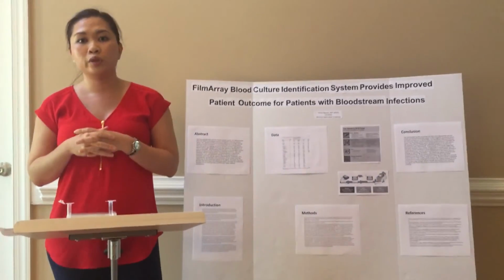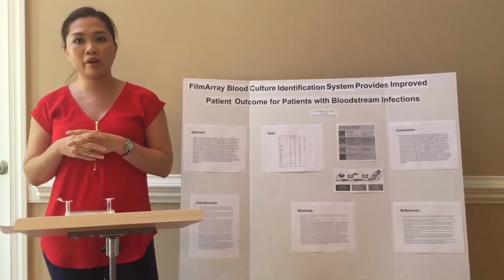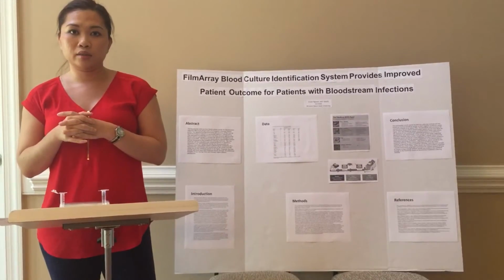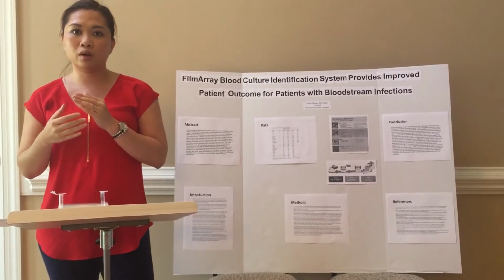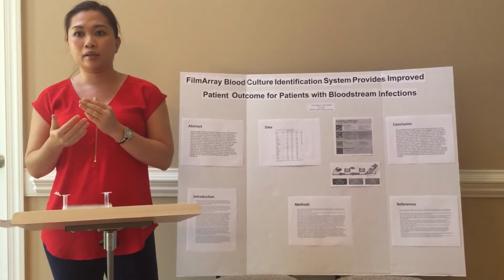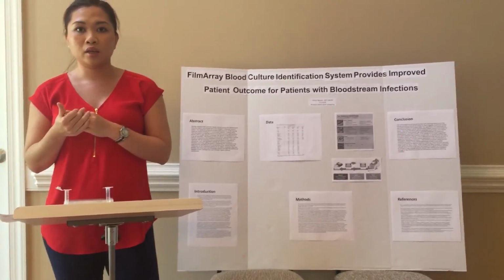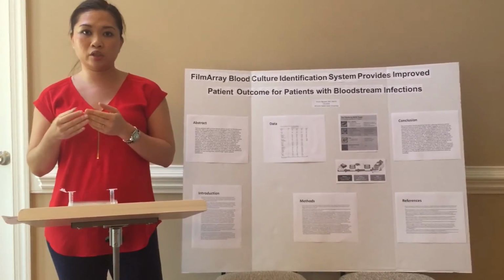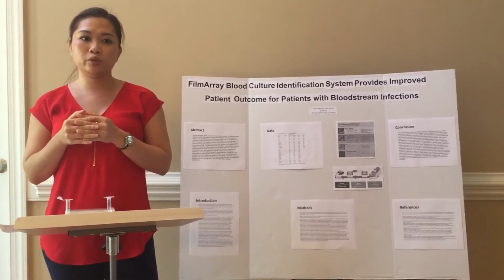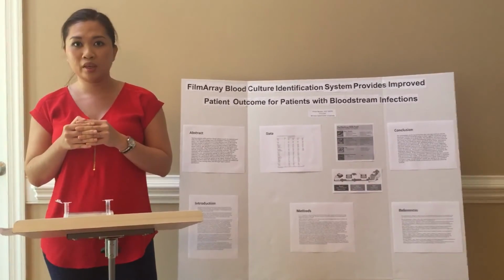the traditional culturing method and the FilmArray blood culture identification method should give us very similar results. The positive side is the FilmArray should give you a more accurate result in a faster time, and the doctor should be able to give the patient antibiotics a lot faster compared to the traditional culturing method. This is the reason why I think that we should be in favor of the FilmArray blood culture identification system.